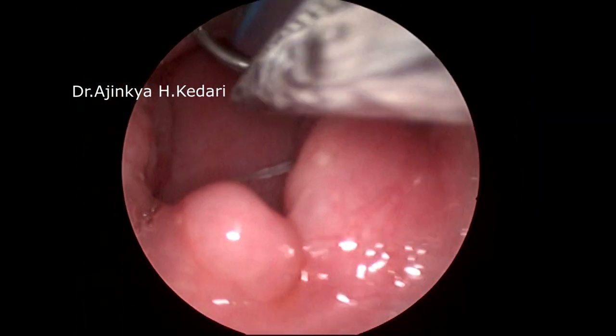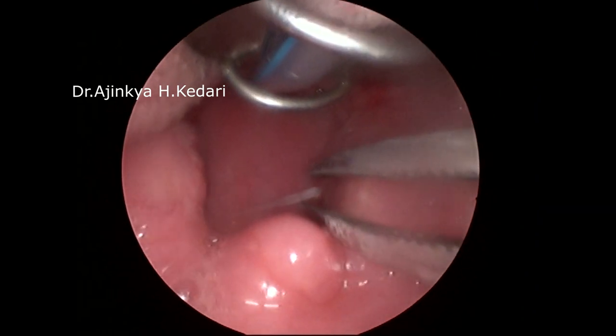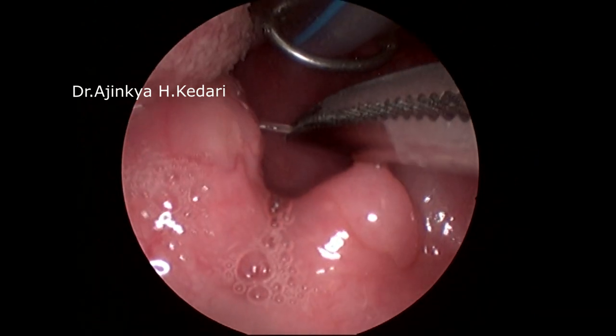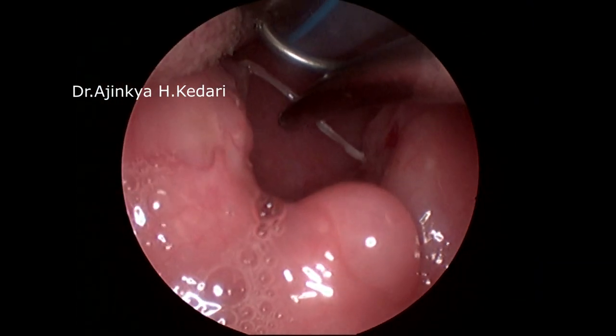What I'm going to do here is use a serrated forceps. As you can see, my forceps has a lot of serrations so that I can have a proper grasp on the fish bone. The trick I'm going to use here is to hold the fish bone and completely remove it sideways first, as you can see.